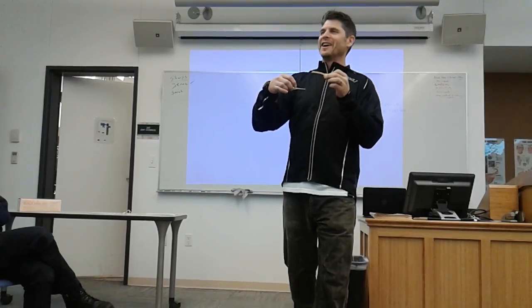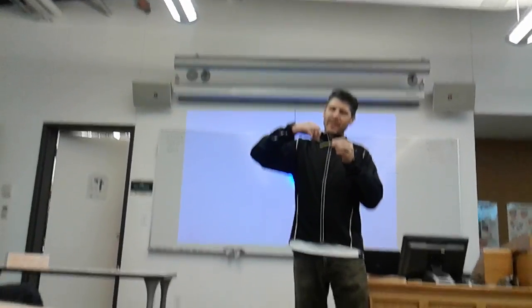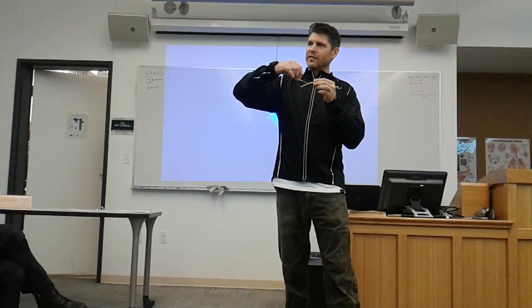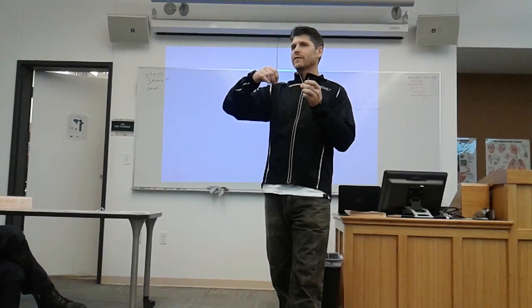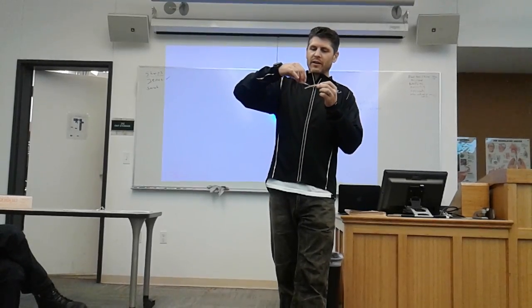So I'm seeing kind of a lot of, I'm gonna get the vein. And that probably doesn't feel great. Well, they don't feel a whole lot, but they see it. In any event, is it there? Nope, I'm coming back, redirecting, going in. So fishing's not good, but at the same time, if you have to fish, then fish right, right? So bring it out, redirect, go in.